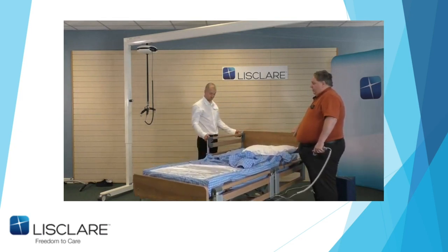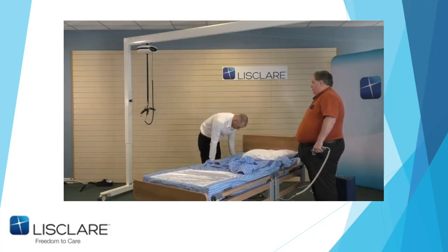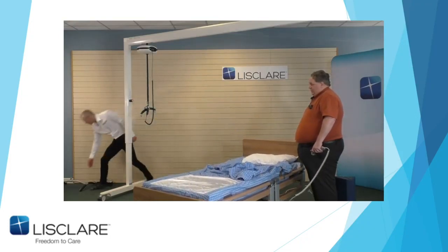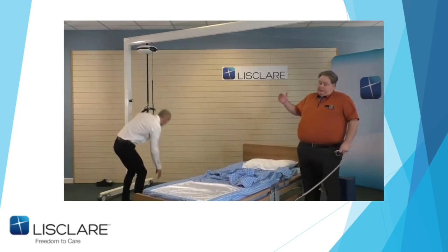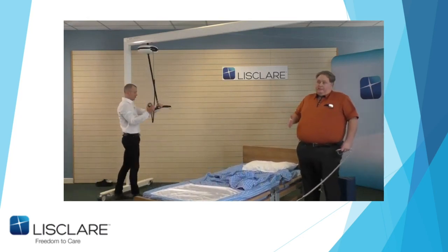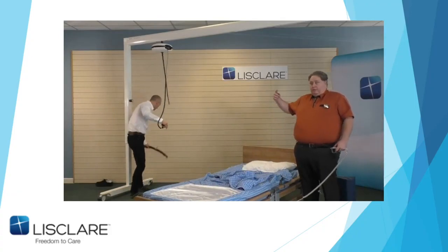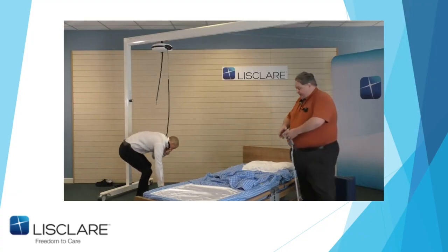So he's going to change things around a wee bit here. So he might have to change the spreader bar, John. Again, just to put on the plus size one, please. And this will do both. So what John's going to do is use the gantry to move me to the side of the bed. Then he's going to disconnect one half, use the shorter side, and rotate me. But John has to always try and stay within my field of vision.